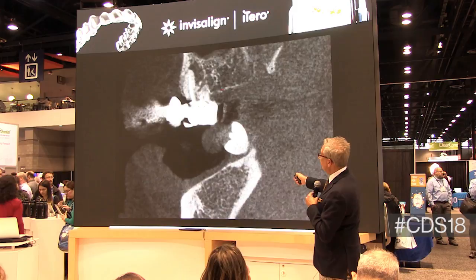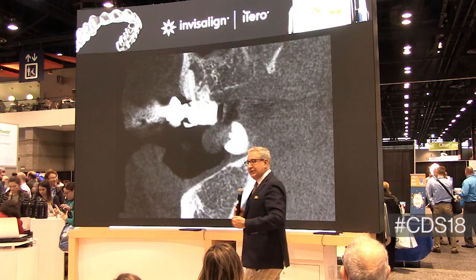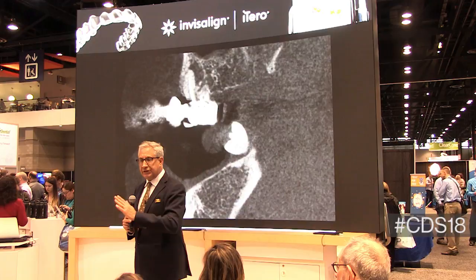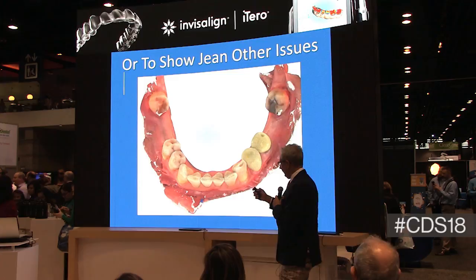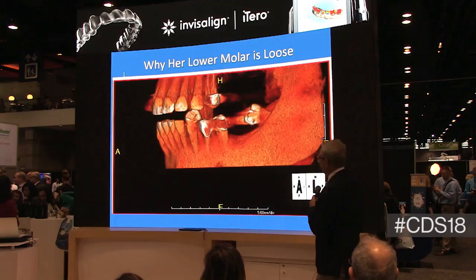So now what happens is my patient is in here, and I'm allowed to be the general of who she's going to go see. So if she goes to the endodontist, I'm sending this record. If I'm going to have to take out number 20 on her lower arch and number 17, I'm guiding my team where we're going. So imagine now, same cone beam, a 10 by 8.